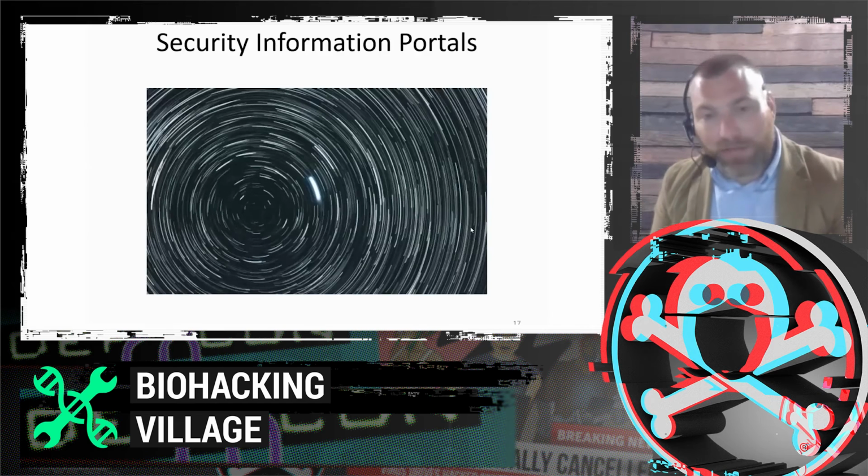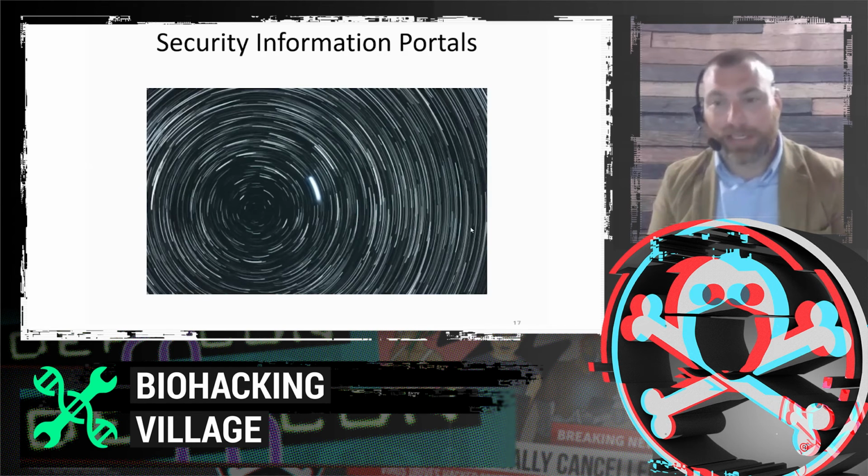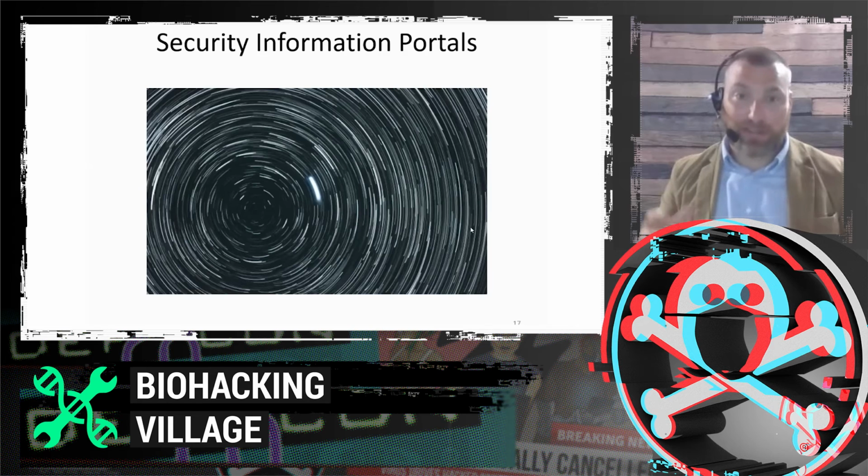Just some sample questions, pretty standard. How do you get this information? Again, I can only imagine on the HDO side, if you have 1,300 different third parties, even if each manufacturer has their own information portal where all of the MDS2s and security white papers and SBOMs are in that one centralized location, you still have to go to 1,300 different portals to get that information.